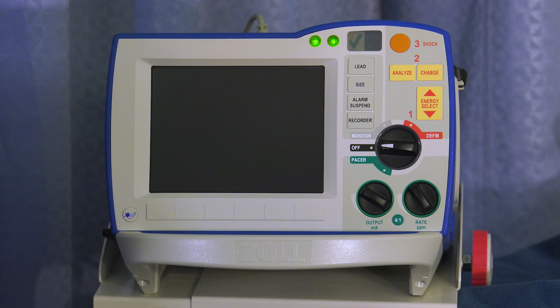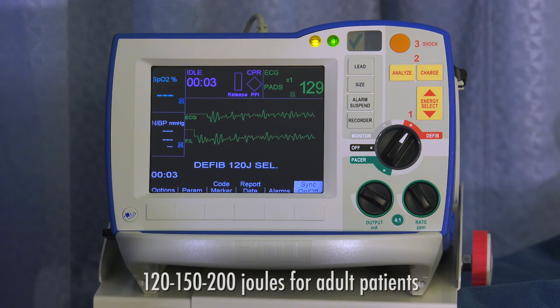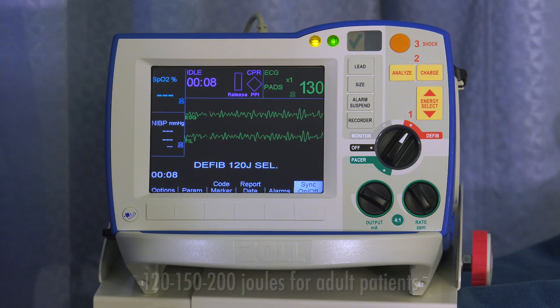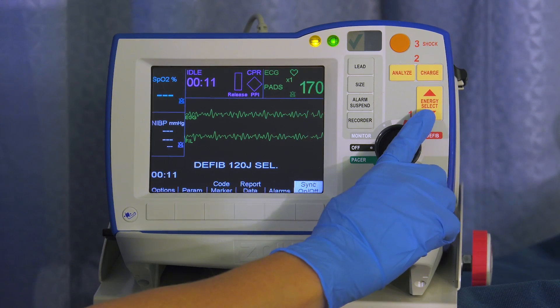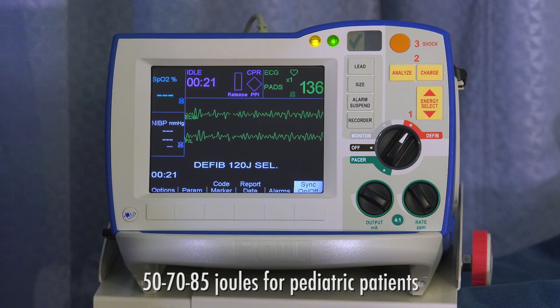Defibrillation with hands-free electrodes is a simple 1-2-3 operation. Step 1: Turn the mode selector to defib. The default defibrillation energy protocol for the Zoll R series with the rectilinear biphasic waveform is 120, 150, 200 joules for adult patients. ALS providers can change the energy setting manually by pressing the energy select button up or down. The default defibrillation energy protocol for pediatric patients is 50, 70, 85 joules.